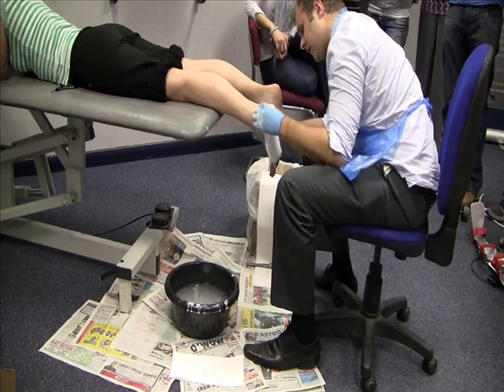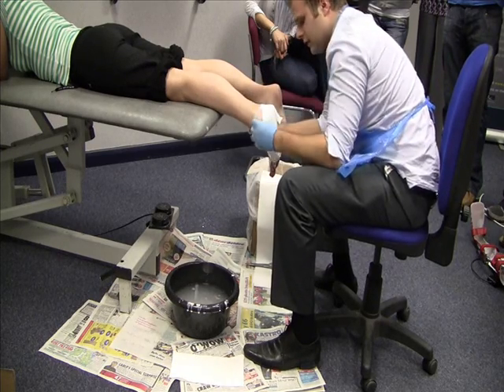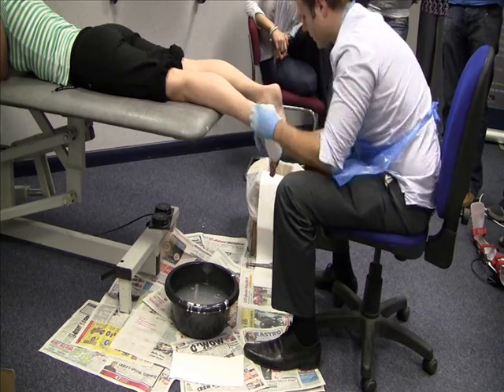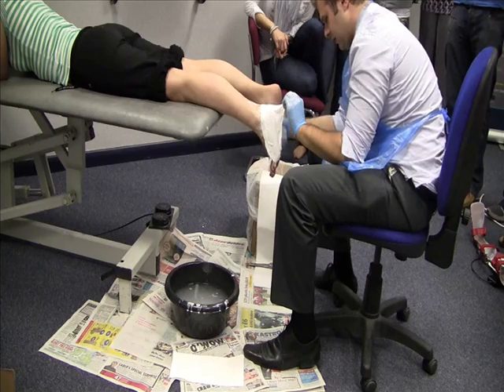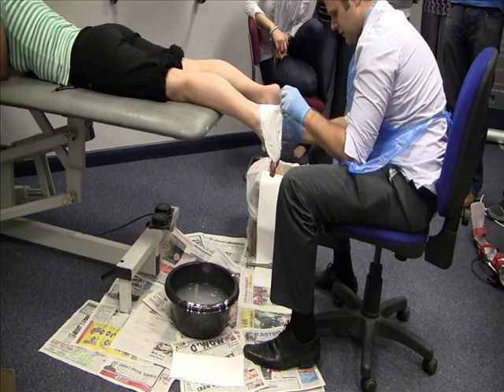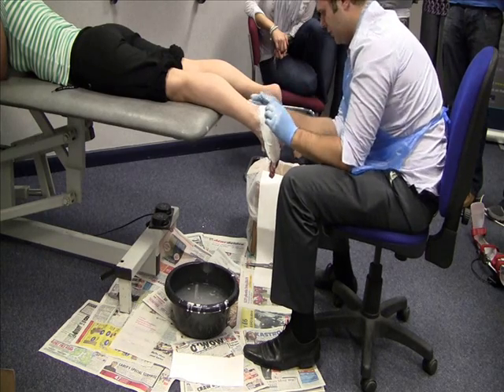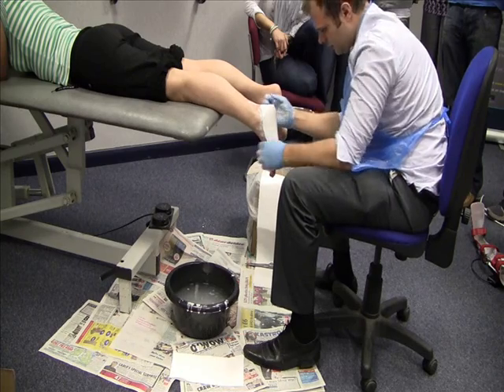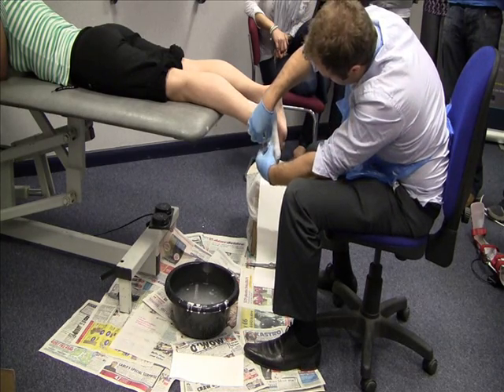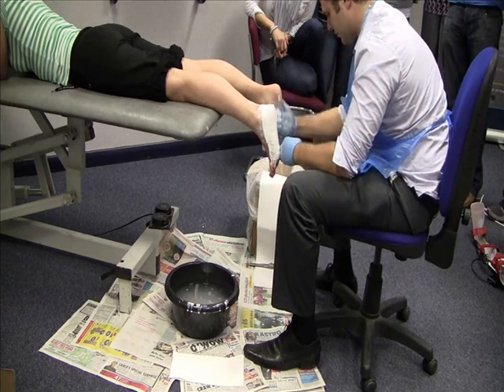Smooth down the medial side. If you need to, you might want to shift it up slightly if you're trying to capture the base of the malleolus. Just smooth down the medial side. Fold, try and move that lump away to the side, and then smooth down the lateral side, making sure you keep those double edges for easy removal.